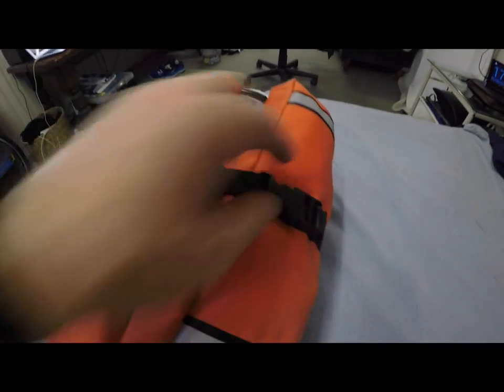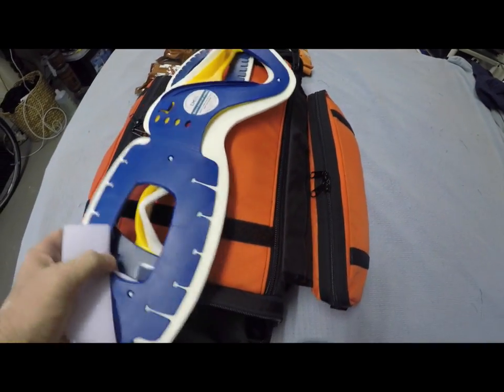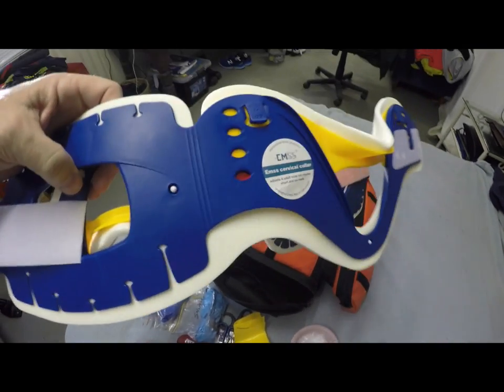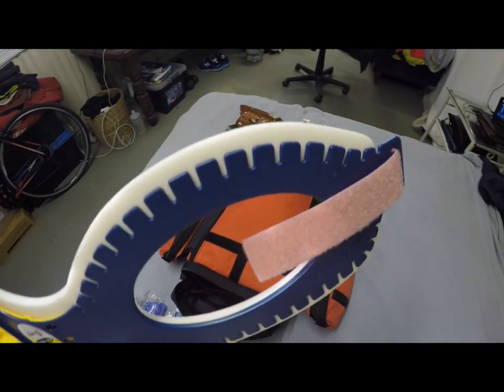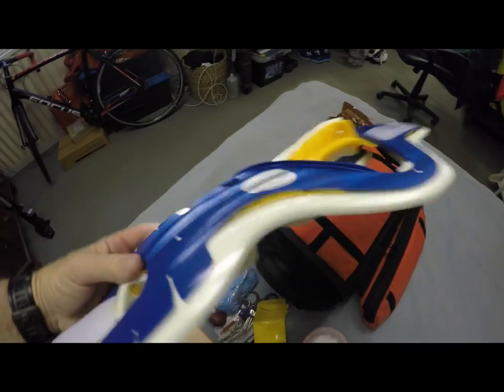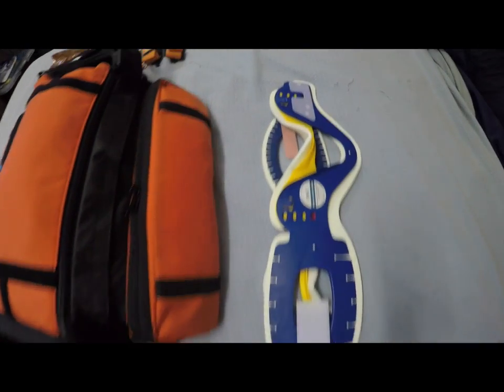Now we open it up. In the middle you have two collars: an adult collar and a pediatric collar, which is pink — that's how you know. Pink strip is for pediatric, white strip is for adult. You've got those two sitting in the middle, and if you didn't need those in trauma, you take them off and put them aside for now.